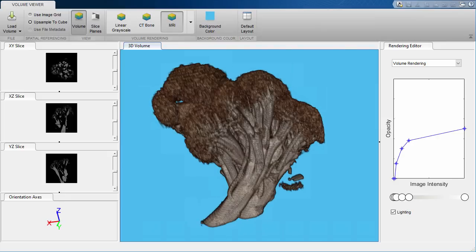So in this example, we saw that visualization can be a first step and also a great intermediate step when working with 3D data. Feel free to check out this app and a variety of other image processing toolbox apps for 2D and 3D image processing.